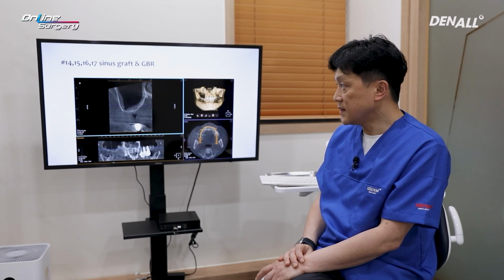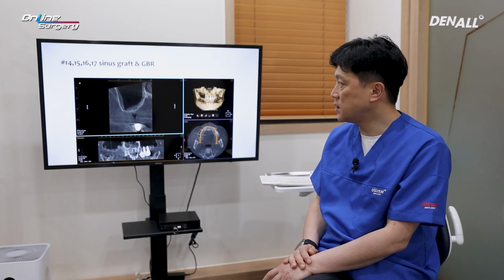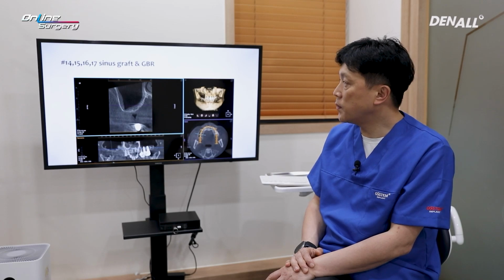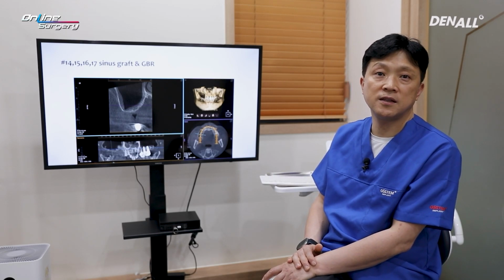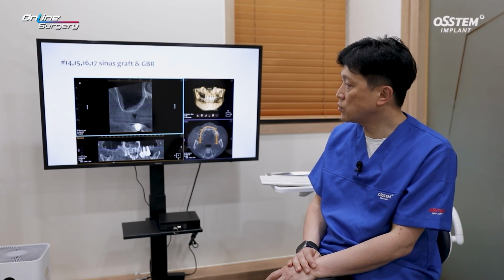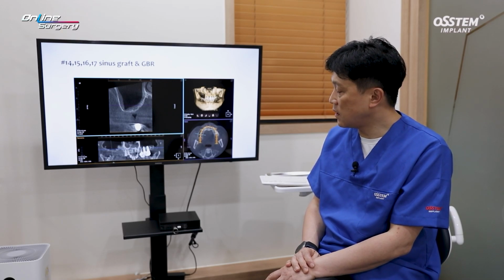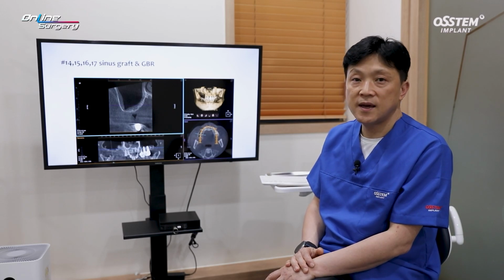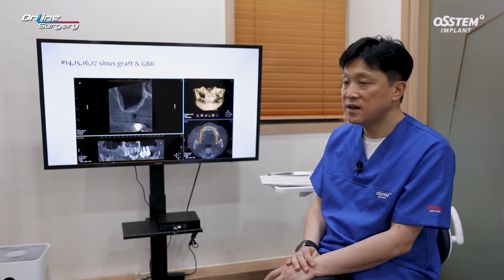In the case of this patient, the lateral wall of the sinus was very thin. If you do osteotomy for the lateral approach unintentionally, the lateral wall can be damaged with just the instruments. Osteotomy needs to be performed with utmost care. Following sinus graft, the GBR was planned for numbers 14 and 15. Let's take a look at the surgery.